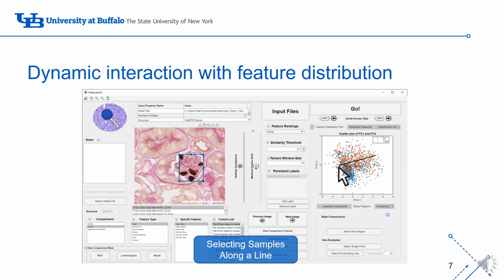In another case, users can select multiple features of interest and view a scatter plot of principal component scores in order to ascertain clustering of certain samples. To assess the gradient in qualitative image characteristics across this range, a line ROI is drawn and images are pulled off the scatter plot at equidistant points.